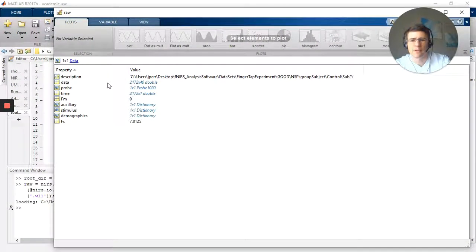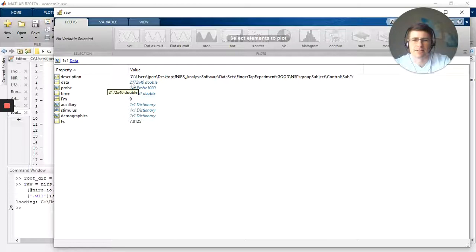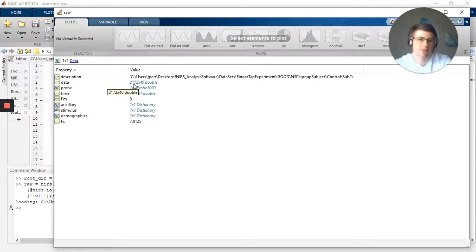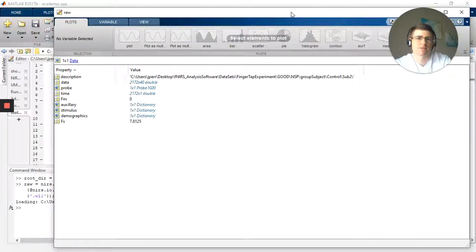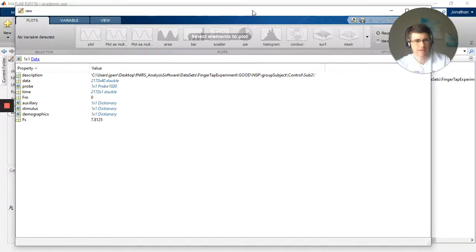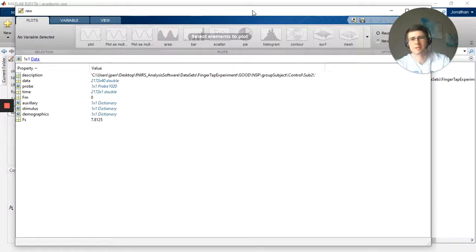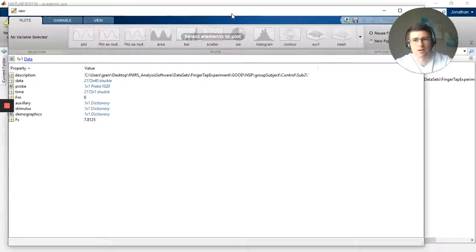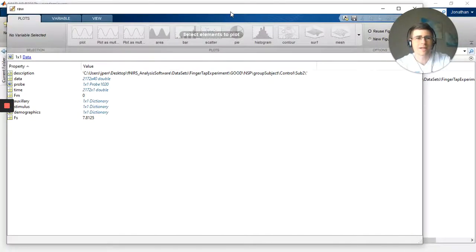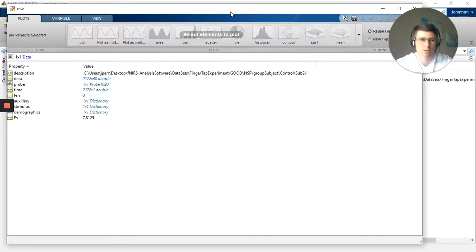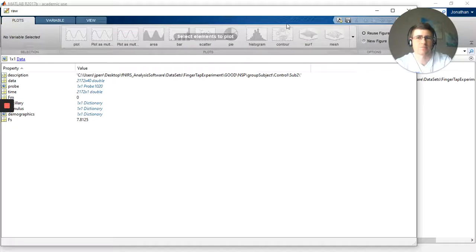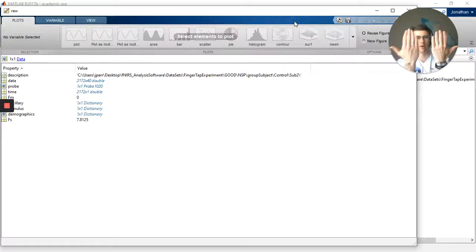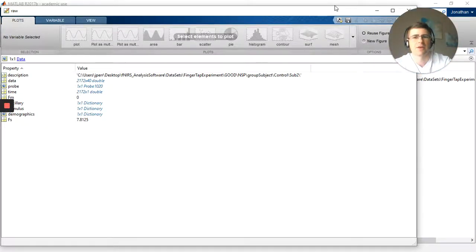The one thing I do want you to notice is I have 2,000 time points, a little over that, and 40 columns. The 40 columns, the time points are just data time points, times when data was collected. The 40 columns however are 20 channels times 2, because I have two wavelengths of data. So there are two wavelengths, wavelength 1, wavelength 2, and they paste them together like that.